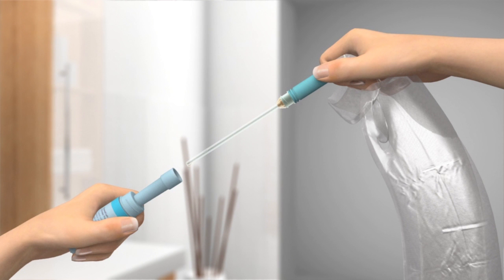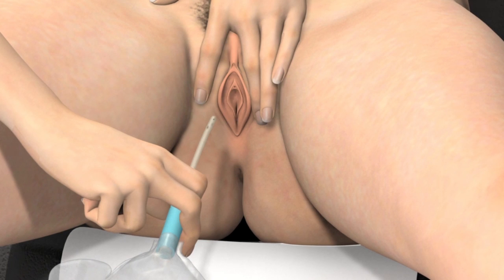Make sure that the catheter does not touch anything before you insert it into the urethra. If it does, you must use a new catheter. Touching the sink, your clothes, or skin, for example, will contaminate the catheter and can potentially cause infection.